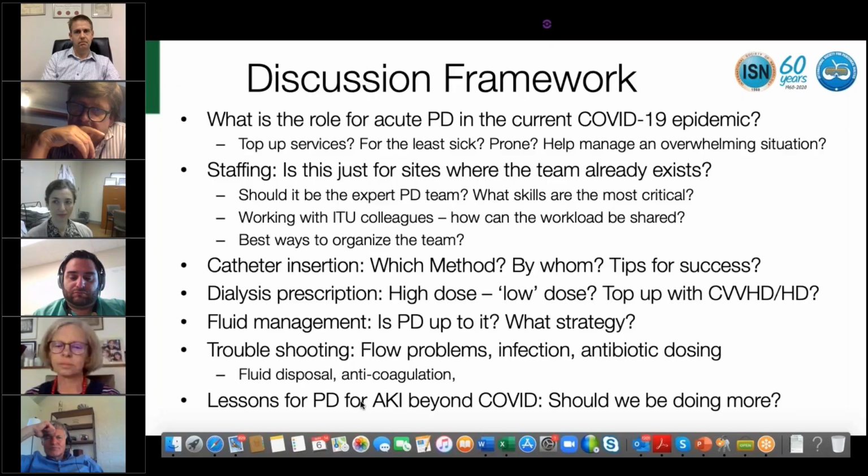There's no reason in 2020 why one can't get ultrafiltration in real time delivered from a cycler as it's taking place, and to leverage a lot of the remote monitoring to help support people to deliver it in critical care. So I'd say that's a third pillar in terms of a direction for the future.